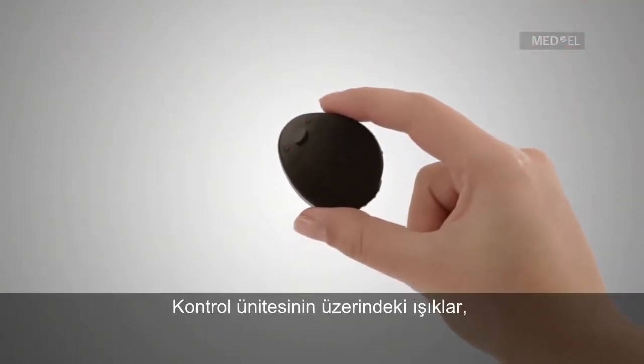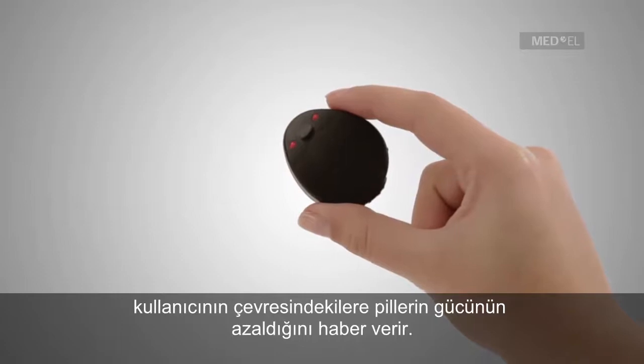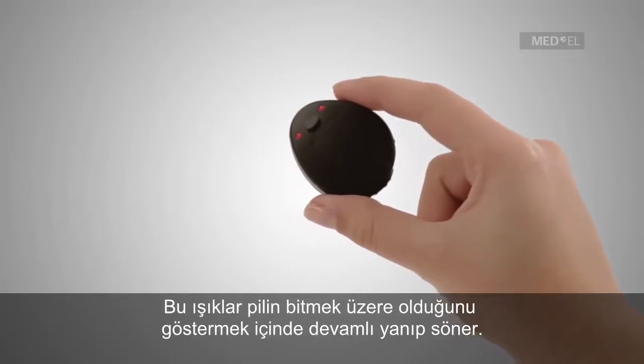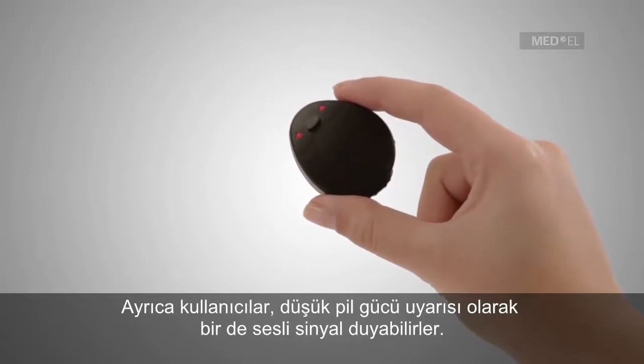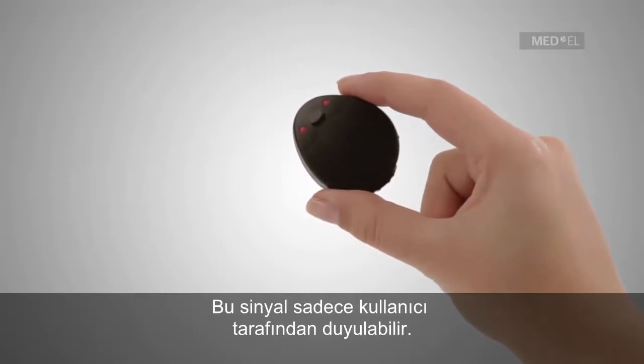Lights located on the control unit provide a visual indication to parents or caregivers if the battery is running low. Lights will blink continuously to indicate low battery. Additionally, users may also receive an auditory signal indicating low battery life. This signal can only be heard by the wearer.